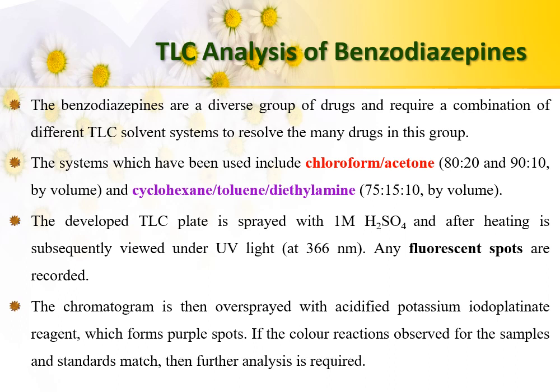diethylamine. The developed TLC plate is sprayed with 1 molar H2SO4 and after heating it is subsequently viewed under UV light. Any fluorescent spots are recorded and the chromatogram is then oversprayed with acidified potassium iodoplatinate reagent which forms purple spots. If the color reaction observed for the sample and the standards match, then further analysis will be required.